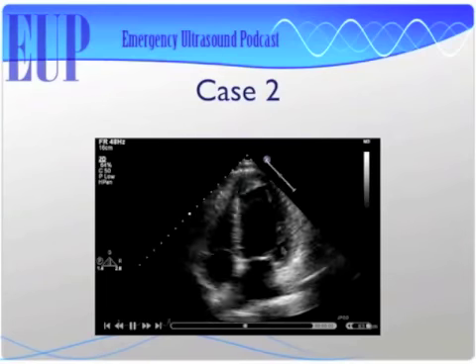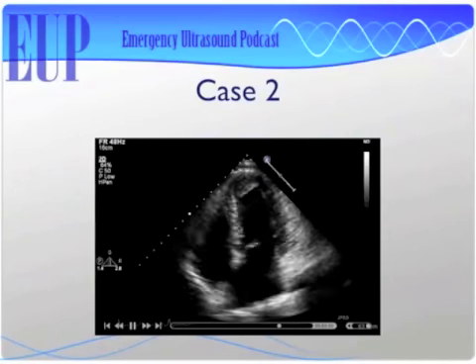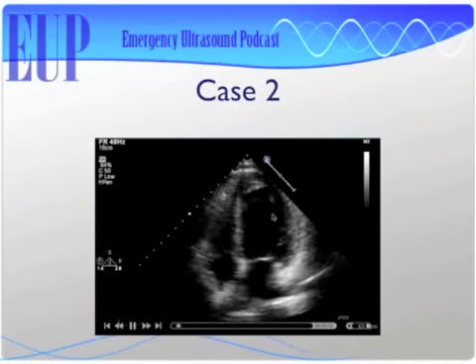So we could either call the cardiologist and say all that, or we could say, hi, this is Dr. Dawson. I'm calling to tell you that I've got a patient with a blah, blah, blah lesion based on bedside echocardiography. LAD. All right, awesome.